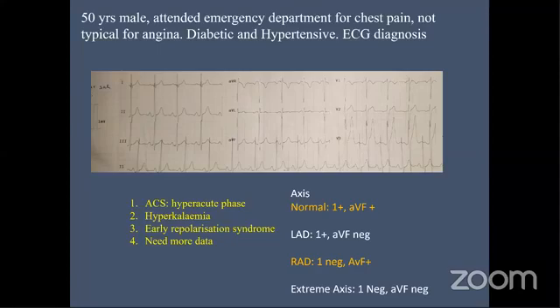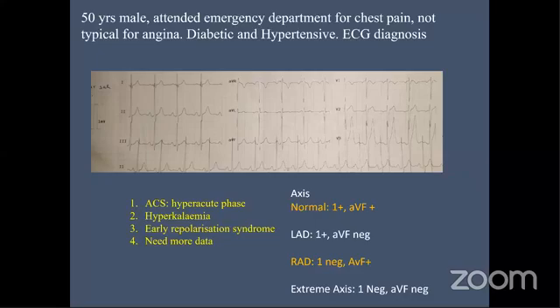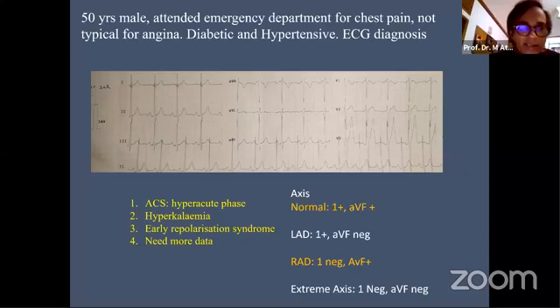Sir, may I comment, sir? Yes. Firoz, welcome. Sir, regarding standardization, one millivolt equals 20 millimeter. So the size of the T wave is doubled up. This is the message. It is probably a normal ECG.